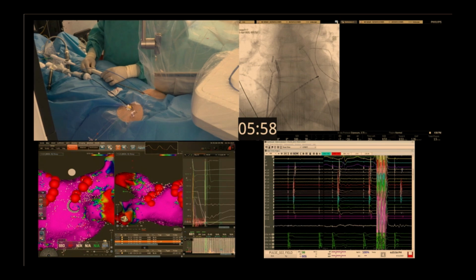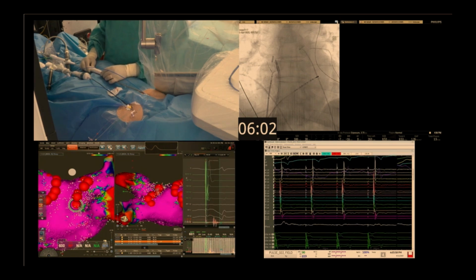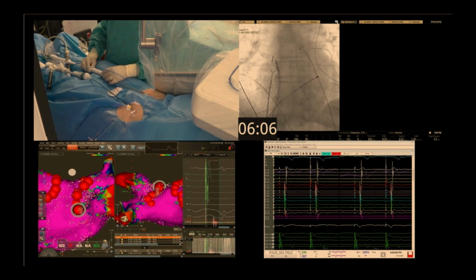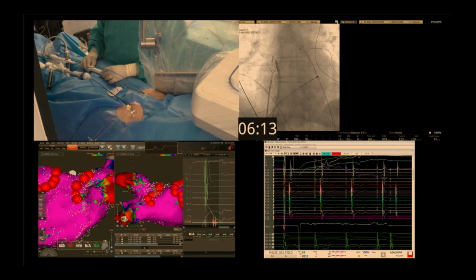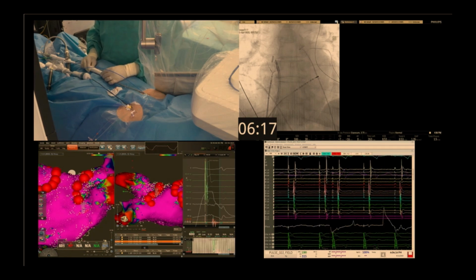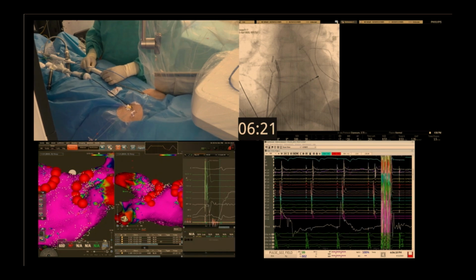Right now there's a race by most of these companies to try to optimize their waveform so they can get a good atrial lesion for AF ablation, because that's the market that they understandably are chasing. But I think eventually we, the EP community, will have to understand the dose response of these things to do what you're suggesting or asking.